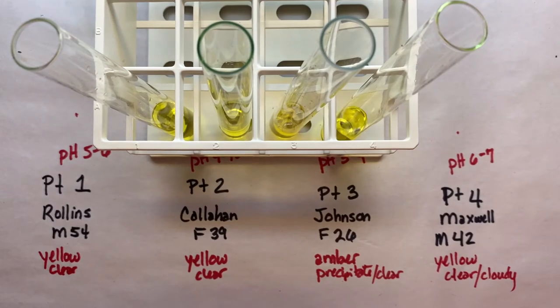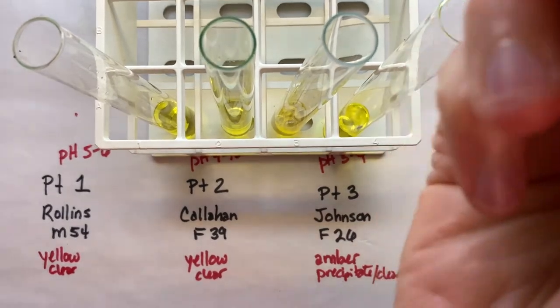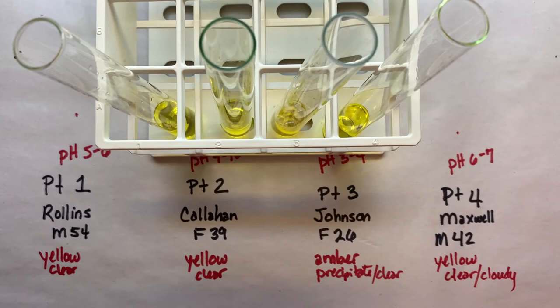All right, so now we've got all 4 tubes, and now we're going to add 10 drops of Biuret to each. So you guys count for me. Check this up again. All right, here we go.